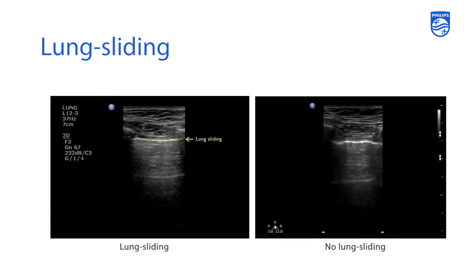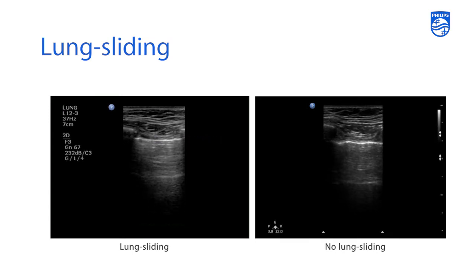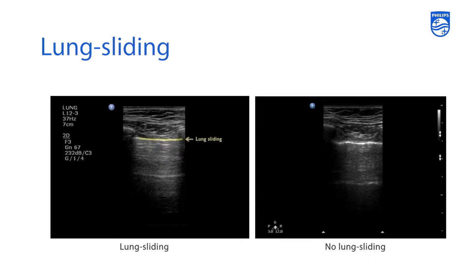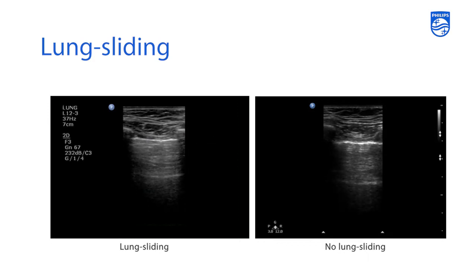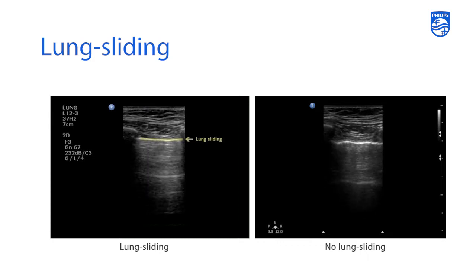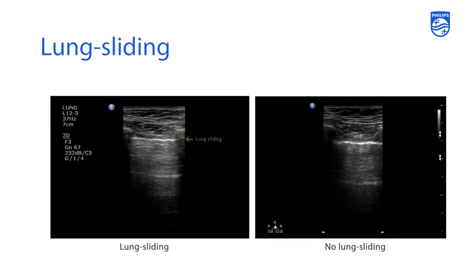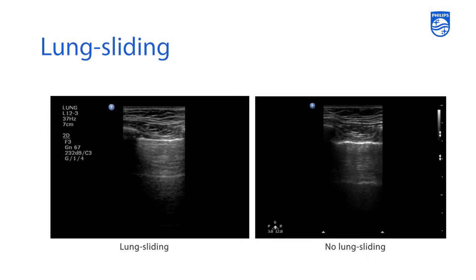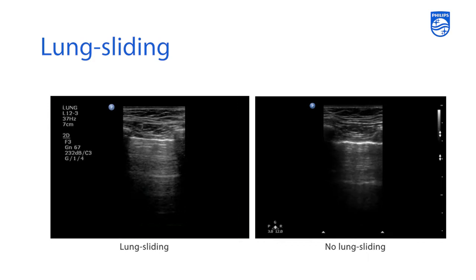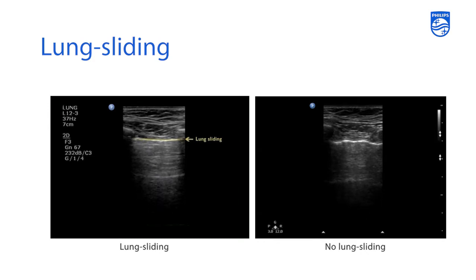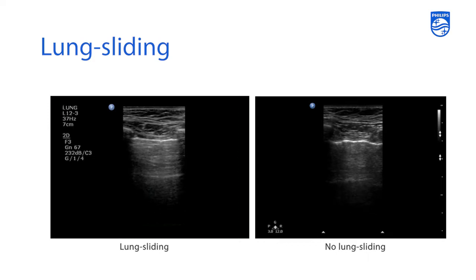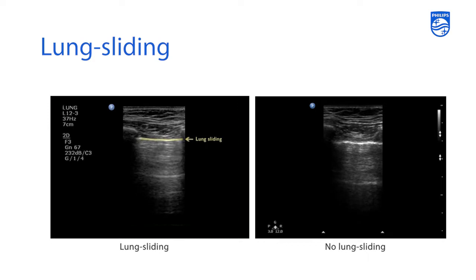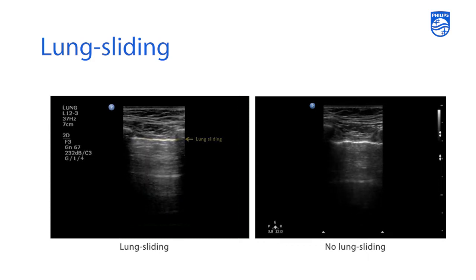In a patient with normal lung function, you should see lung sliding — this to-and-fro motion of the pleural line as delineated on the left of the screen. On the right, you see no lung sliding. You see this bright white pleural line without that to-and-fro motion. It seems that every time the patient is breathing, the chest wall itself is getting pushed up, and you see the pleural line moving upward with the chest wall in that attempt at a breath and lung expansion, but you don't see the pleural sliding back and forth. This would be concerning for a pneumothorax.